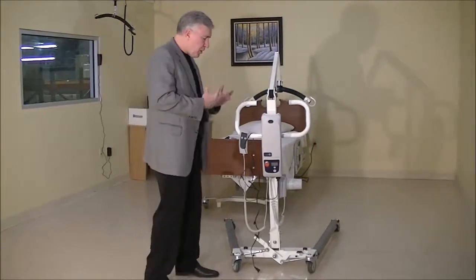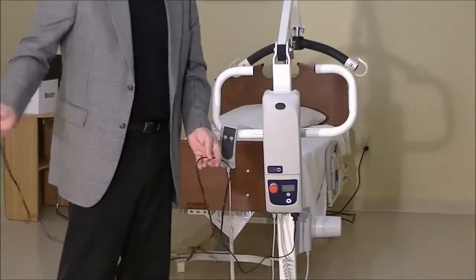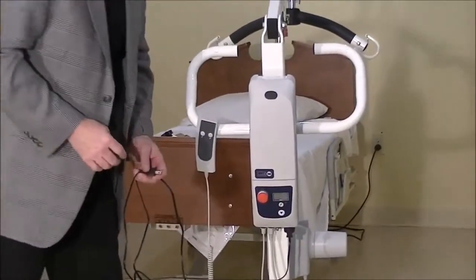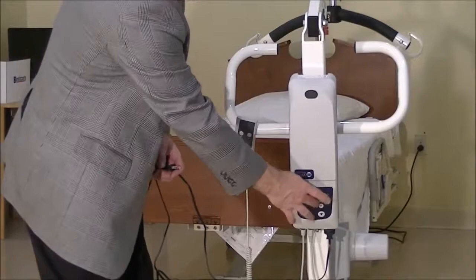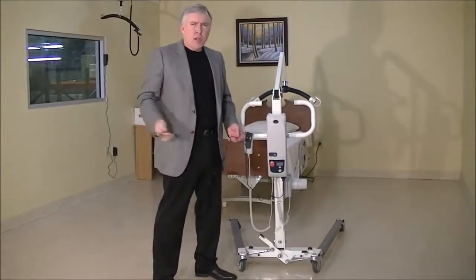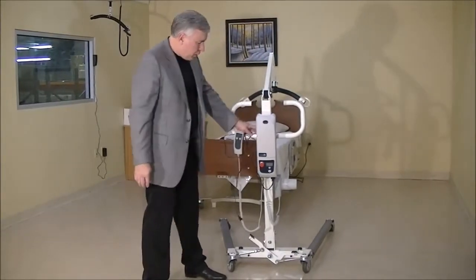Step number one: this is our charging cable that we plug into the wall to charge up the lift. If we've got it plugged into the wall and the green light is blinking on the control box and the battery is displaying on the control box as charging, the lift is not going to work. The lift only works when you unplug it from the wall. Make sure you've got it unplugged or the lift won't operate.